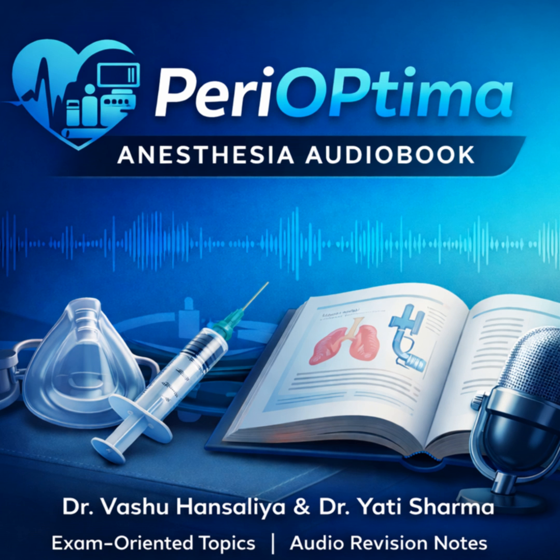This is a very high-yield exam point. For decades, we used SIMV to wean patients off the ventilator. The logic seemed sound. We'd just turn the mandatory rate down from 10 to 8 to 6 and make the patient do more work. But it doesn't work that way. The evidence now strongly suggests it may actually delay weaning. The problem is the variable workload. The patient gets a free ride on the big mandatory breath, then has to work really hard for their little spontaneous breath. It seems to confuse the respiratory center and cause diaphragm fatigue. It's often better to just switch to a fully spontaneous mode.